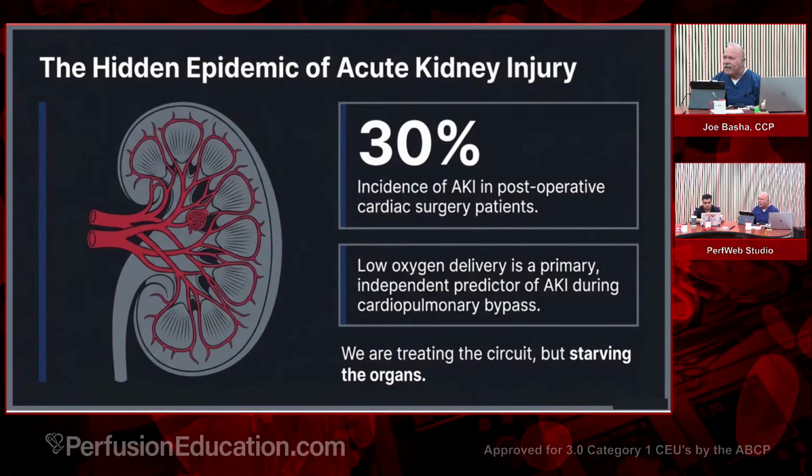requiring dialysis. That probably is still too high in cardiac surgery, but there still is a high incidence of some level of injury. And some of that is going to be associated with the materials that we use, the loss of physiologic pulsatile flow, hemodilution, DO2 decrease. I mean, look at the DO2I. Our floor, some people say 270, some people say 280, some people say 320. All of them are low. Even 320 is low.